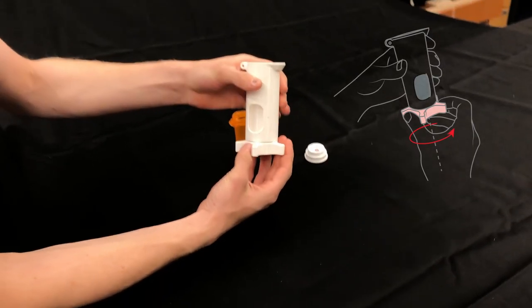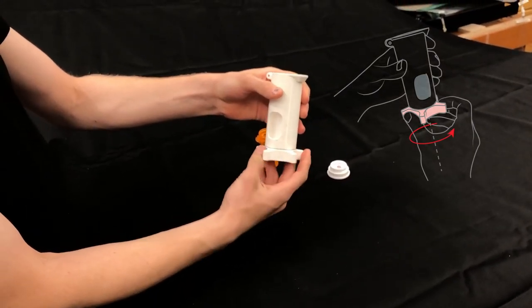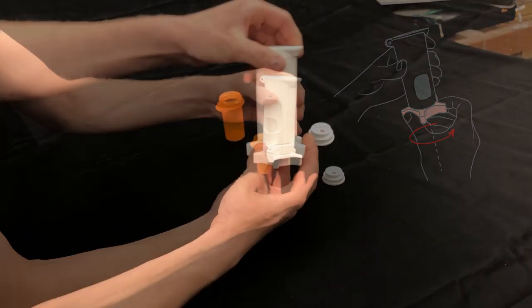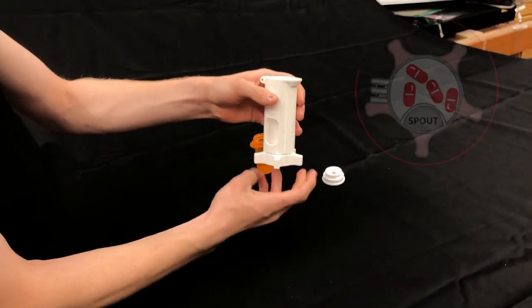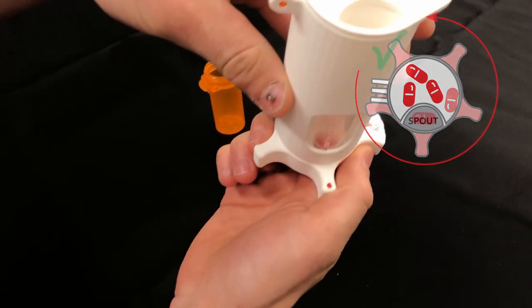To dispense a pill, the main body of the pill dispenser should be held in one hand with the other hand holding the twisting base. The base should be rotated 360 degrees or until the pocket in the twist base lines up with the spout.